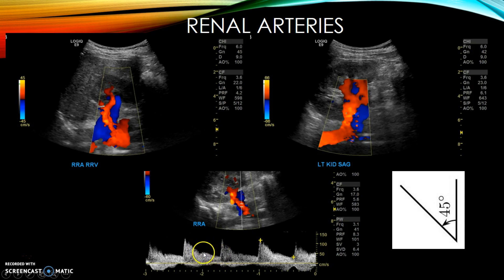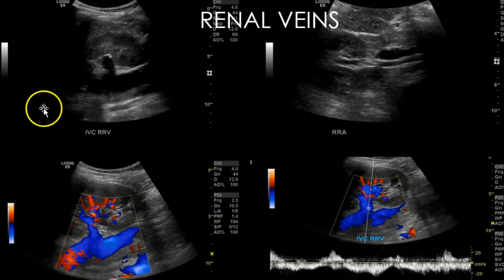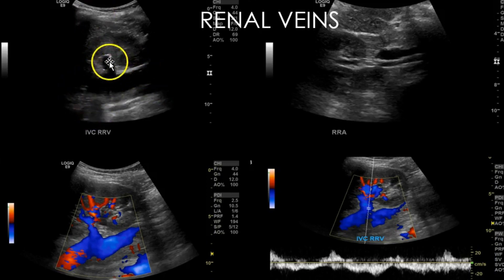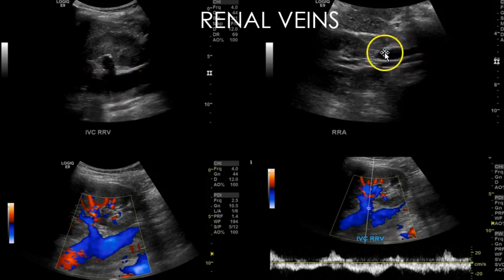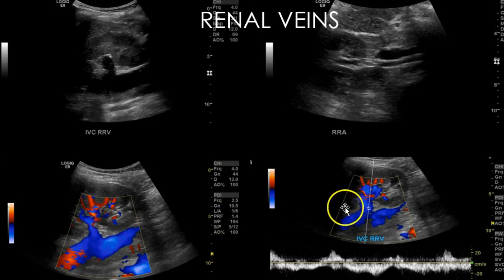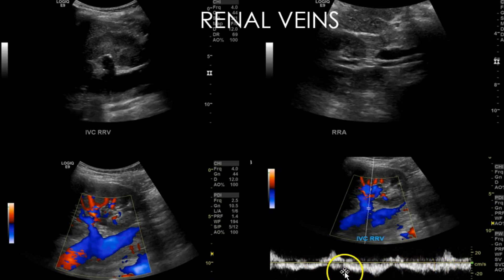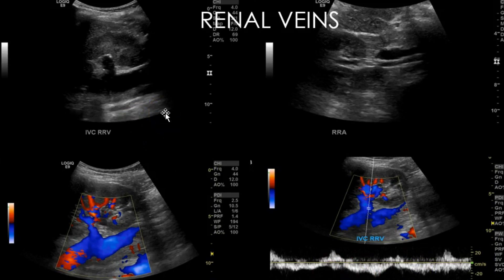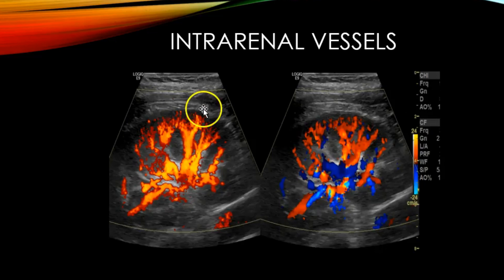You get a nice clean waveform from the flank approach — a very sharp upstroke, a dicrotic notch, and good diastolic flow. Next, document the renal veins. In the coronal view on the right you have the right renal vein and IVC; at the hilum you see the renal artery and renal vein together. Document with grayscale, color Doppler, and pulsed-wave Doppler showing normal phasicity.